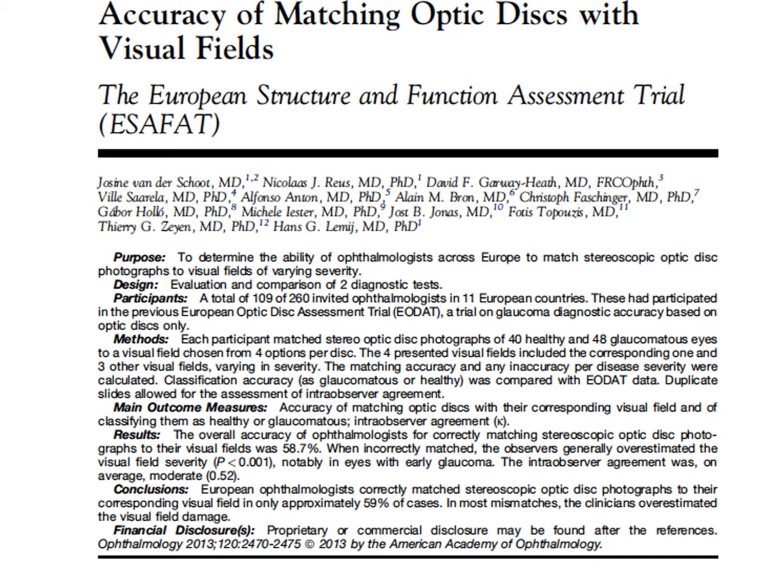The 4 presented visual fields included the corresponding one and 3 other visual fields varying in severity.